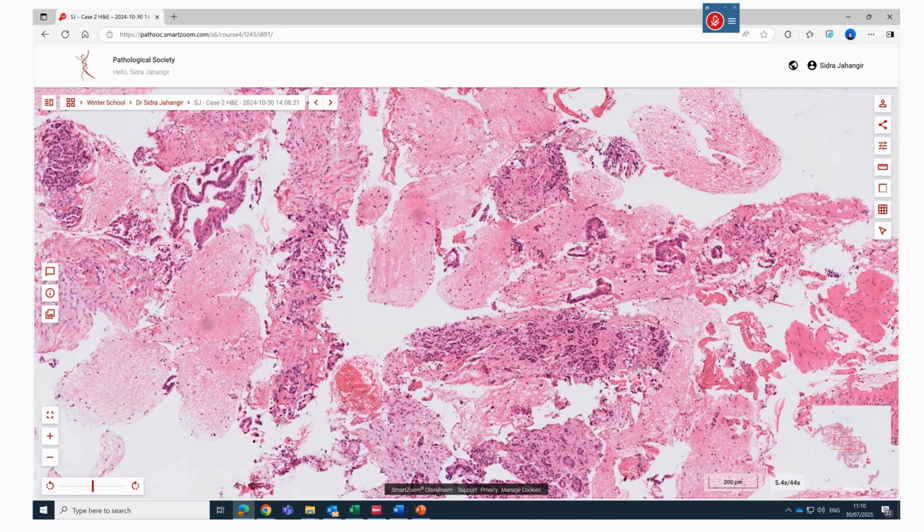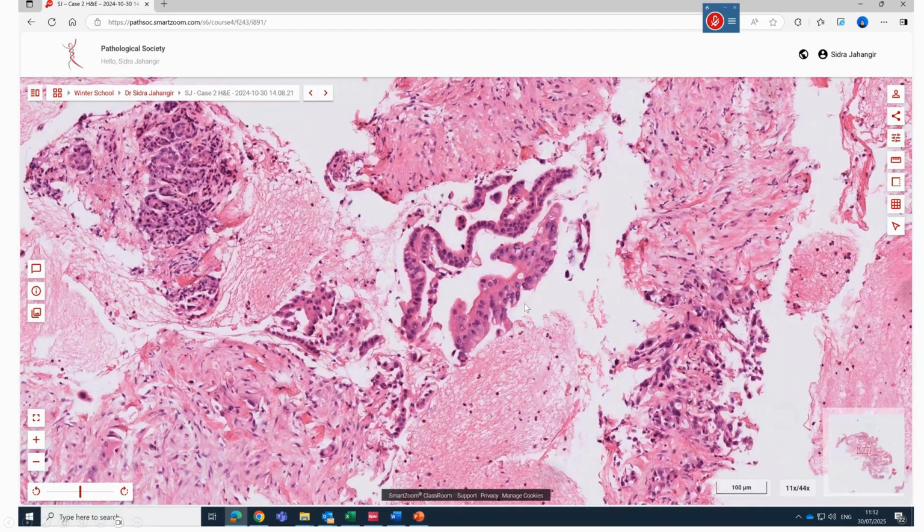And the main lesion can easily be missed if the endoscopist or gastroenterologist is not hitting the correct area, and most of the time what you are getting is the chronic pancreatitis element. So here there is a tumor, ductal adenocarcinoma, no acini, the lobular architecture is gone, and some chronic pancreatitis element here.